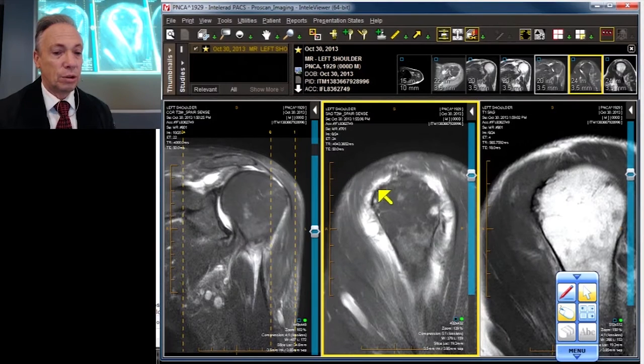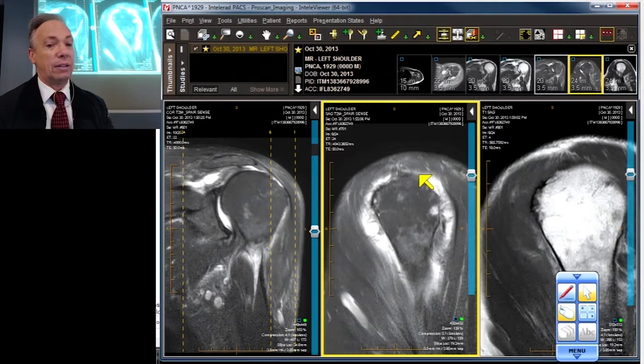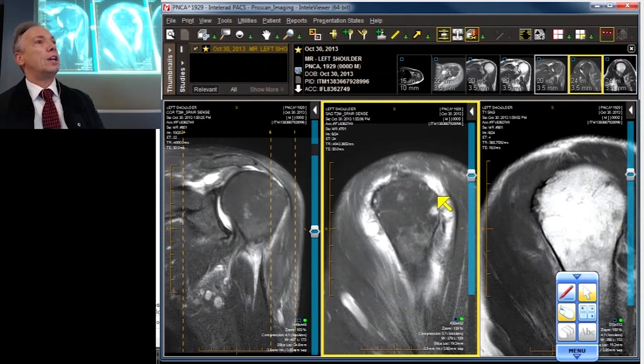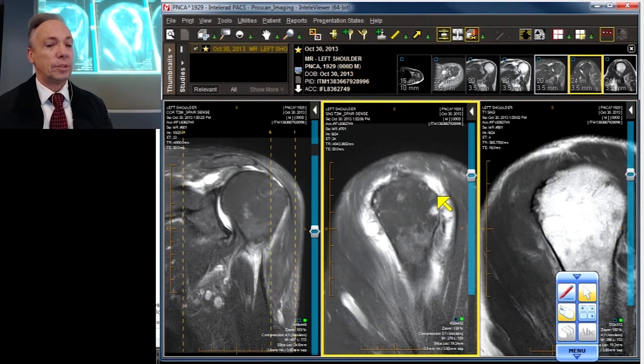It's a complete tear — completeness is confirmed. The infraspinatus is also torn all the way from anterior to posterior — a complete tear. And the subscapularis is demonstrating a partial thickness undersurface tear. The sagittal view is invaluable in telling you the front-to-back length of tears and in identifying and qualifying subscapularis tears.